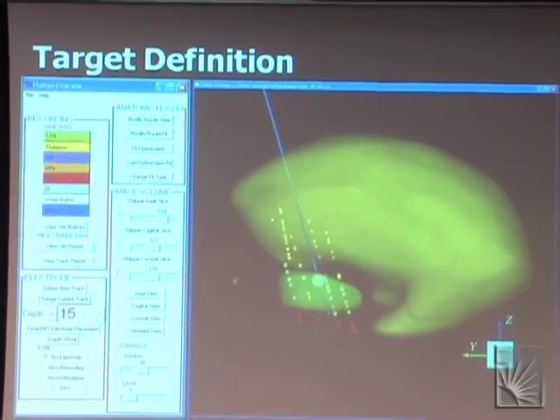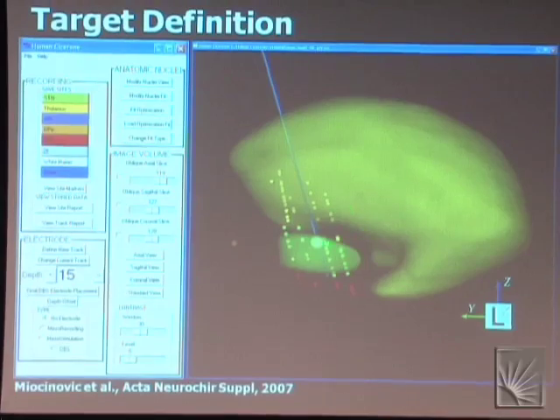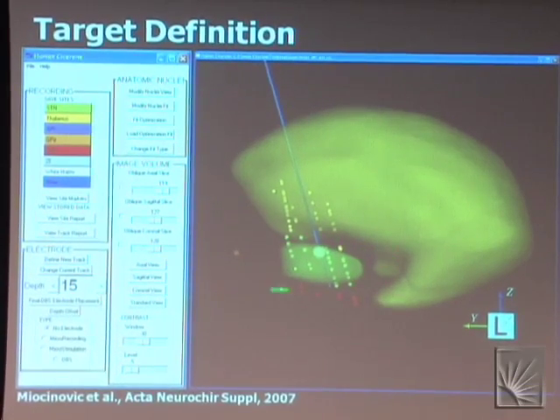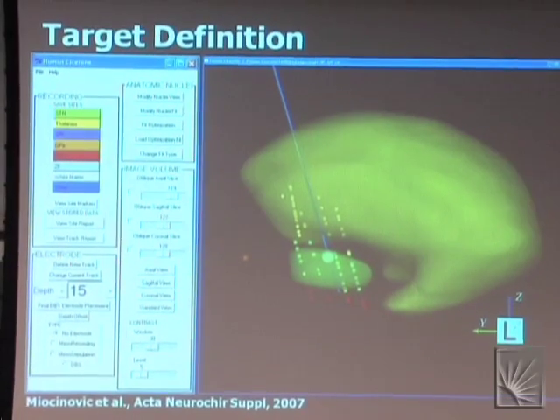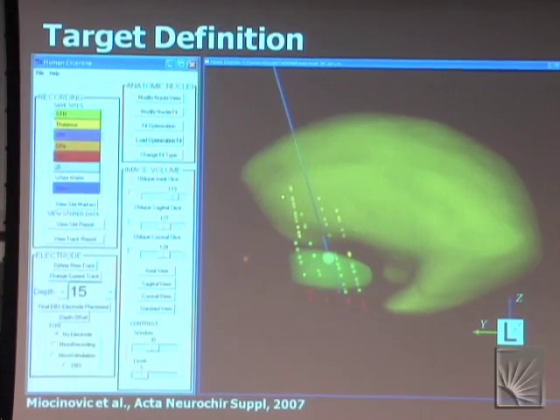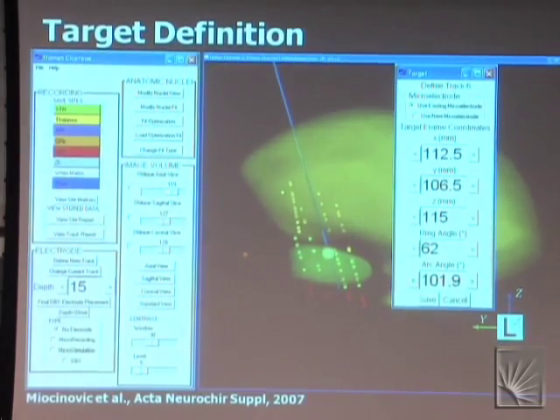So this is the take-home message of why we would be doing this, because it allows us to use information from this brain atlas to help us predict where we're going to get the best possible predicted outcome in that patient, and then hopefully in subsequent patients as well.